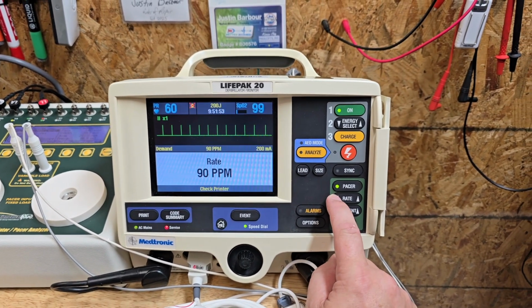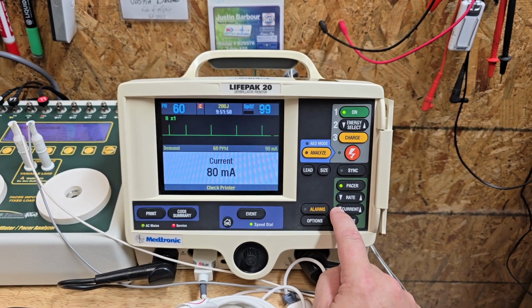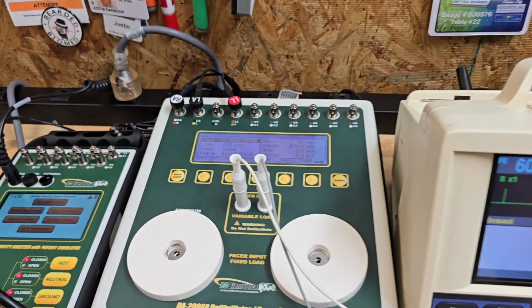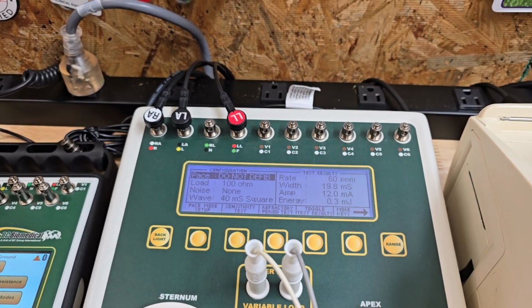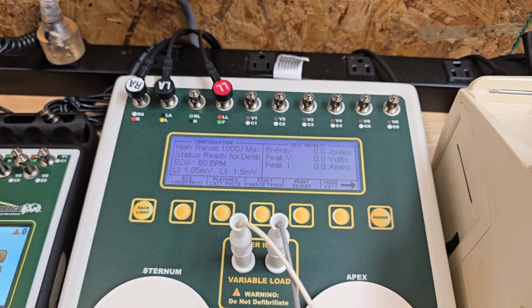Let's go ahead and turn this guy down to 60 and let's turn the current down because that's just a little bit high. Let's turn it down to 10. I like 10. All right. Now let's go ahead and let's test this guy out. So let's hit the range. And now we are back into defibrillation mode.